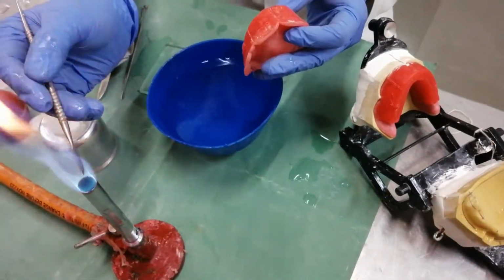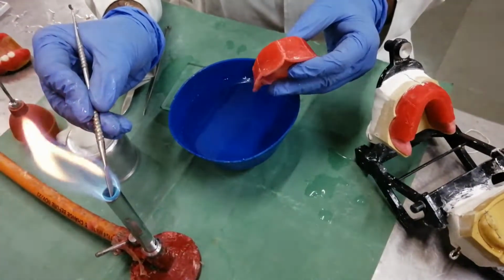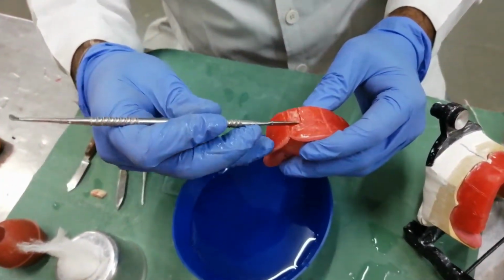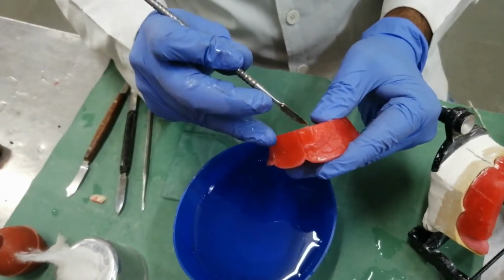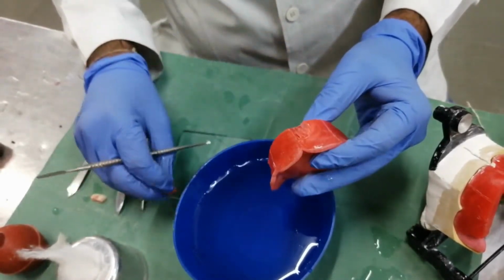Now we will start arrangement of teeth on maxillary record block. First, we will start by arranging the maxillary central incisor. For that, you have to make the socket into the rim for the placement of central incisor. You have to keep in mind the height and width of the crown of the central incisor.